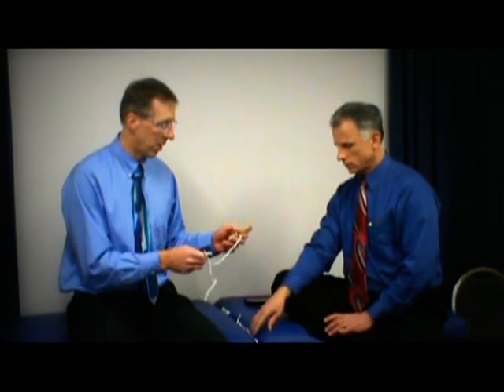I already broke it apart here. Yeah. But they're about $3, so we just give them away. But normally if you as a layperson are going to buy a pulley system, it's going to run 20 to 30 bucks online. Yeah, exactly. So we're going to show you how to make a pulley system. And just to give you a couple examples in which you might use it, you might use it if you have a frozen shoulder, which tends to last a long time, and you want to make sure you're keeping motion in your shoulder.